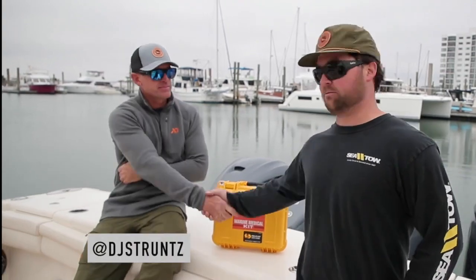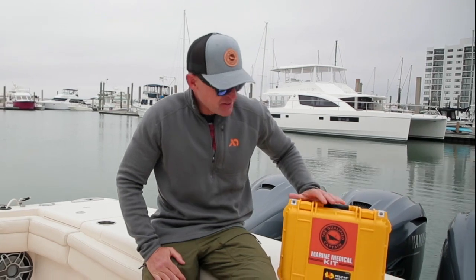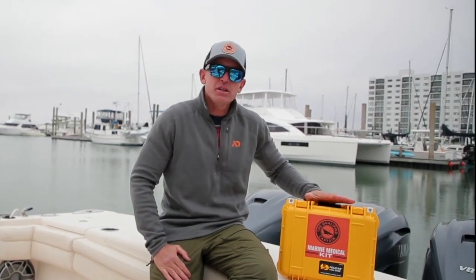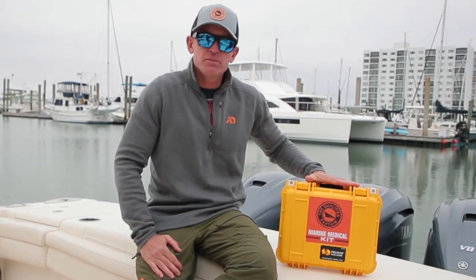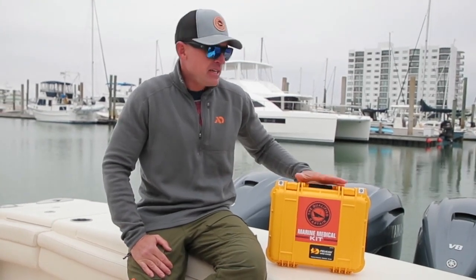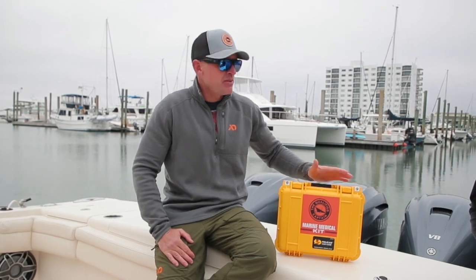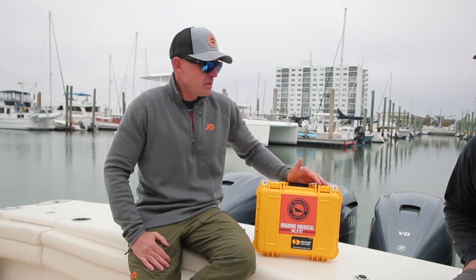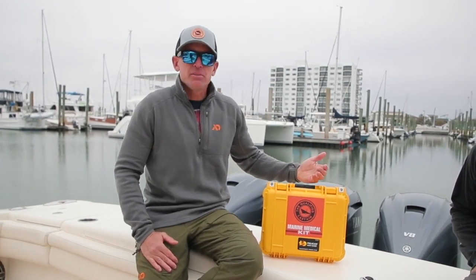What's worth having a trauma kit if you don't know how to use the equipment involved? I got DJ Struntz here with me today, and he's going to basically run down the basics. Thanks so much for having us. We're really excited about this collaboration. This is a new maritime medical kit which meets or exceeds all Coast Guard standards, so it's a great addition for your boat regardless of size. Safety on the waters is obviously a really important thing, and we think it's really important for you to be empowered to be able to treat your family members, yourself, or someone else.